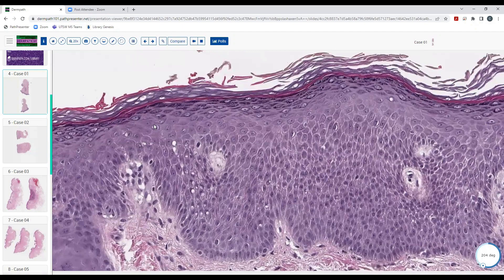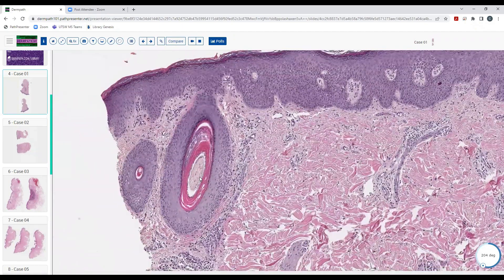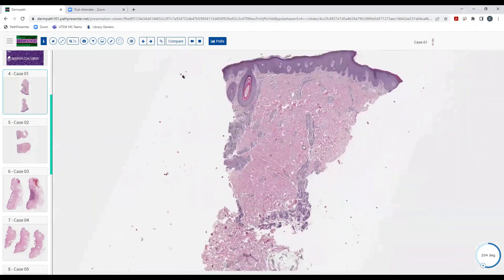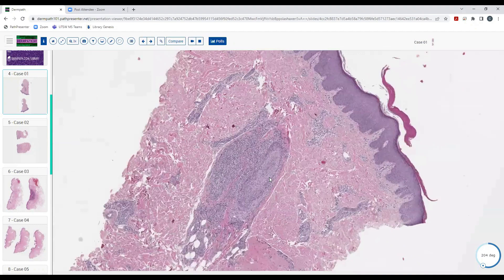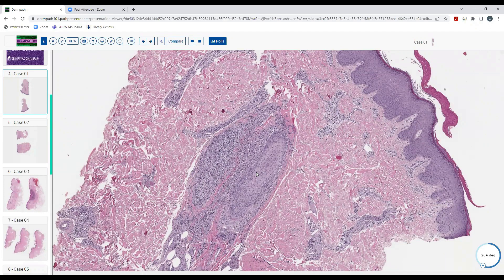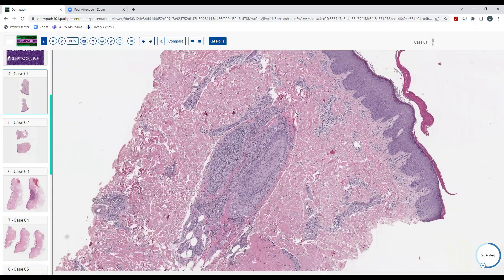I was looking at the cornified layer for organisms and don't see any, which is characteristic of some organisms that like the hair — like Trichophyton tonsurans, which causes tinea capitis in kids. If you don't actually find the affected hair shaft you'll miss the diagnosis. Without it, all you can really say is it looks like a suppurative folliculitis with rupture, possibly bacterial — but in this case it was fungus.